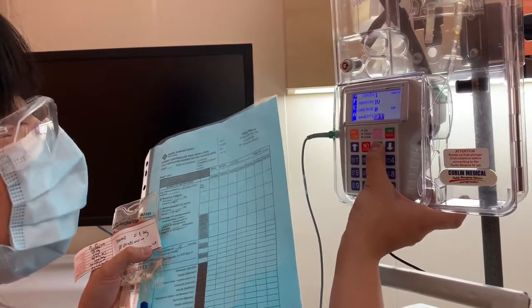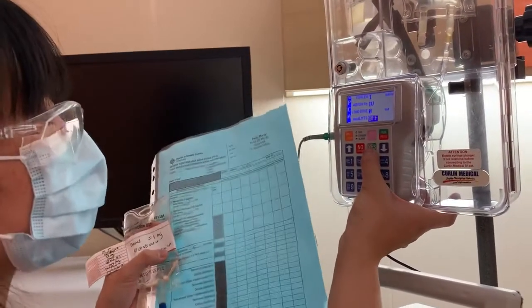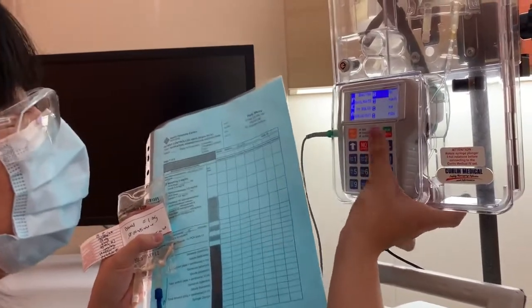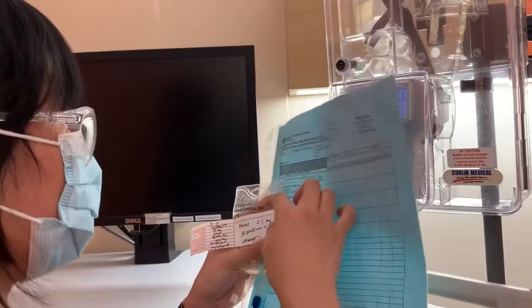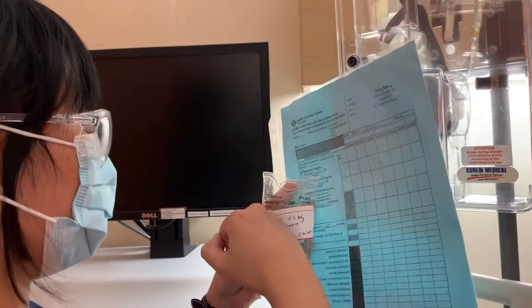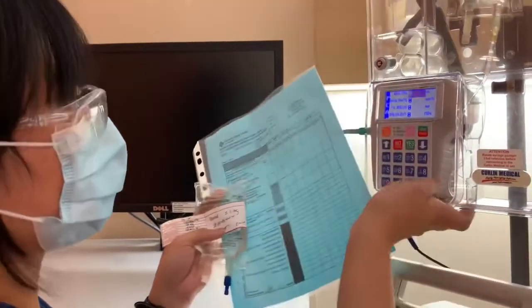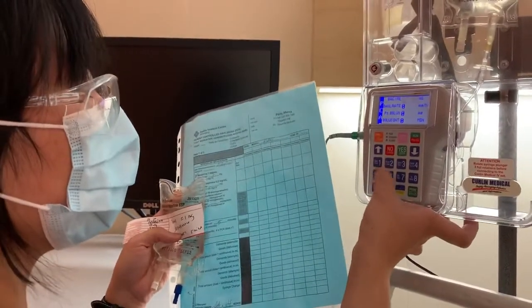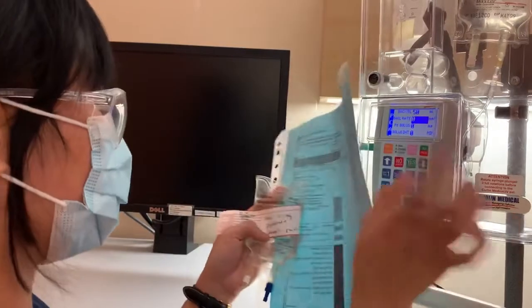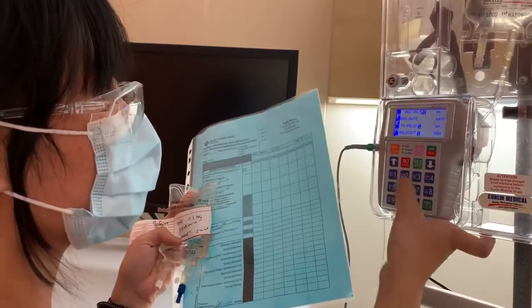Okay, so the med limits, we wanted to stay off as a safety feature, so hit yes, and next yes. Okay, so the bag volume, we know that there's 50 mLs in here. We checked, so there's 45 mLs in the diluent and 5 mLs in the medication. There's a total of 50 mLs, so we need 50 right there. The basal rate, we don't have any. We're checking in our MAR as well.